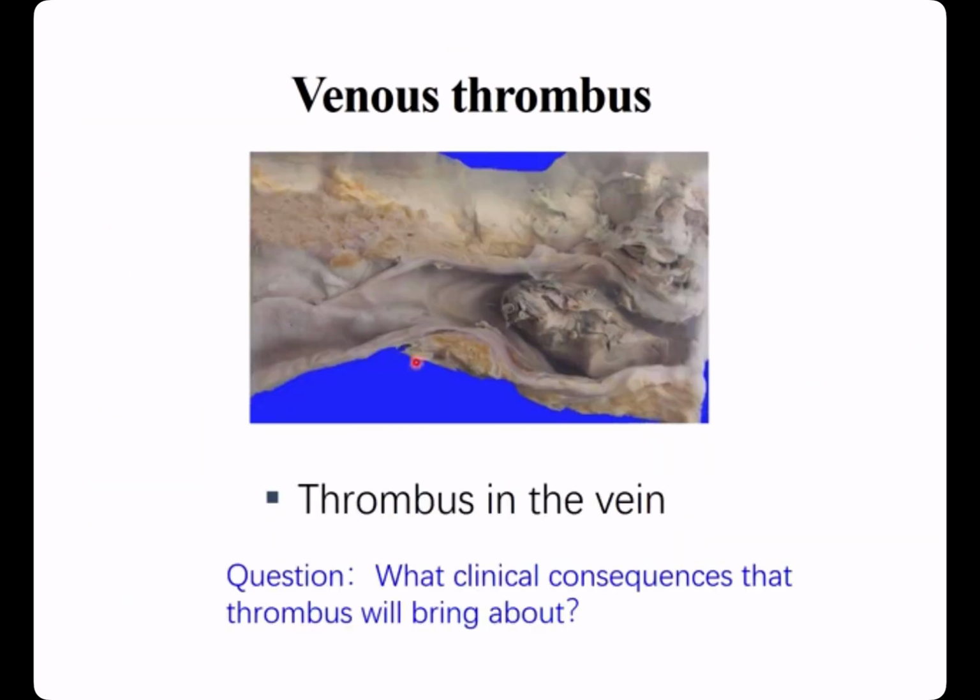This is another thrombus in the vein. Question: what clinical consequences will that thrombus bring about?